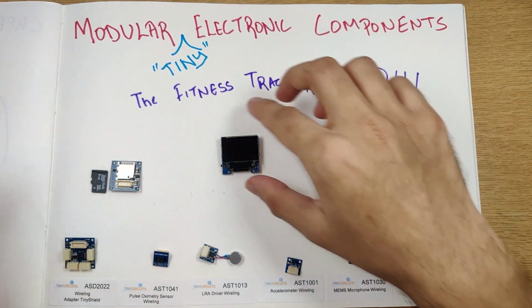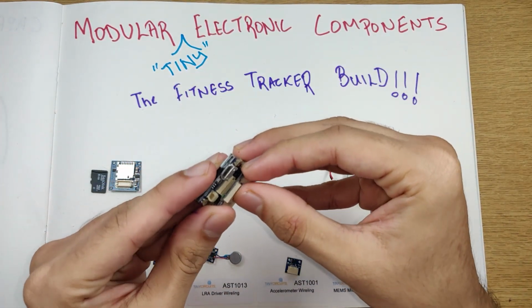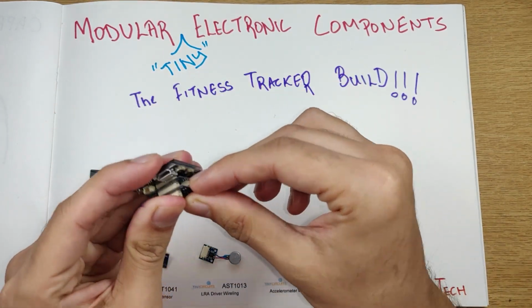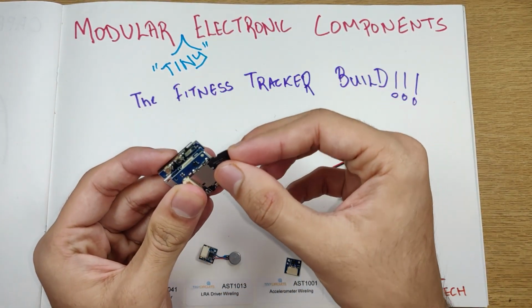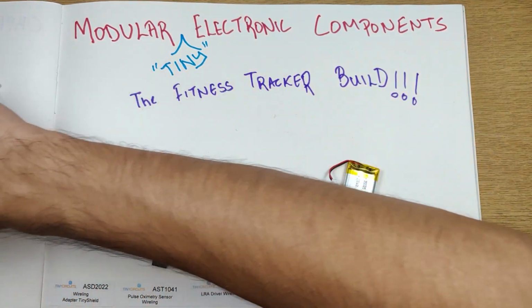For that, we'll have to firstly connect the shield, the adapter shield over here like that. Then we can connect the micro SD shield. That completes the half of the circuit. You can insert the micro SD card into the shield, and that is it for that.